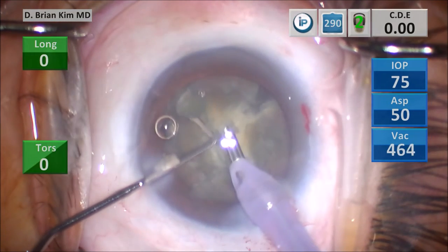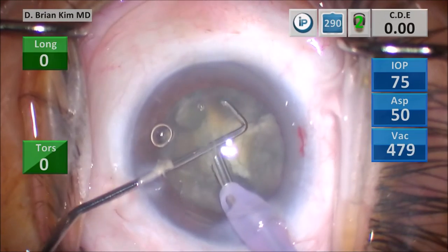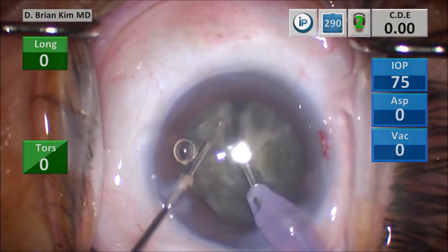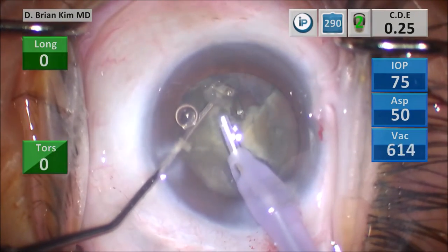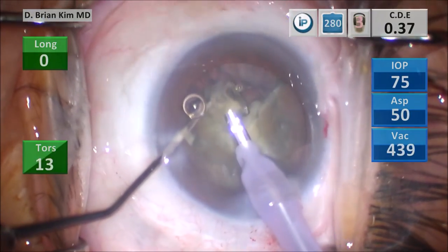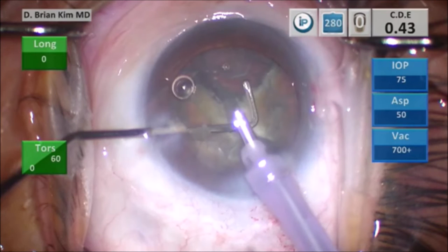Now I'm in the ready position again with the chopper in the flat position on top of the endonucleus. You can see the epinuclear ridge — that is my target point. That is where I'm going to slide the chopper, making sure the epinuclear ridge is above me, and then the phaco tip is in a deep position so the chopper moves towards the phaco tip and bisects that one piece. I then perform successive mechanical fracturing forces, crushing the lens pieces into bite-sized pieces, using a little bit of ultrasonic energy and then primarily high vacuum to emulsify the lens pieces. That was the first quadrant.